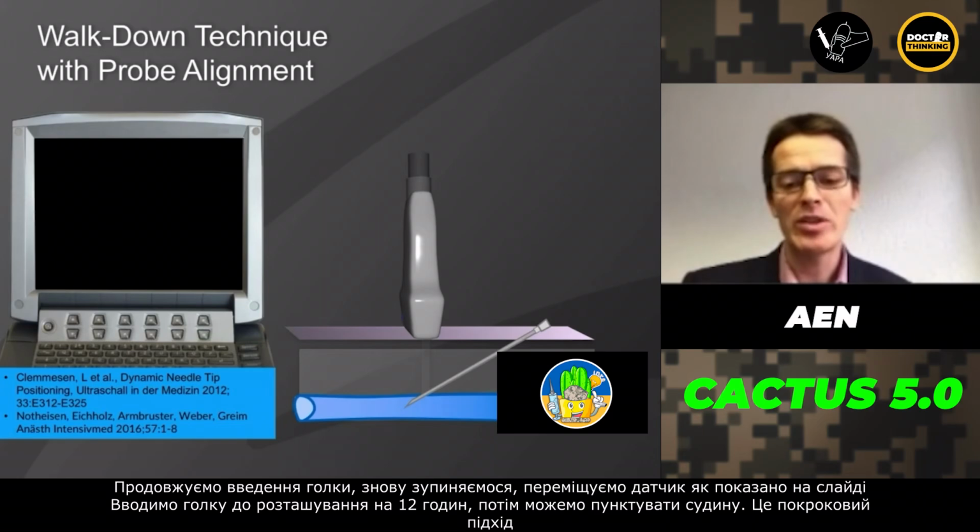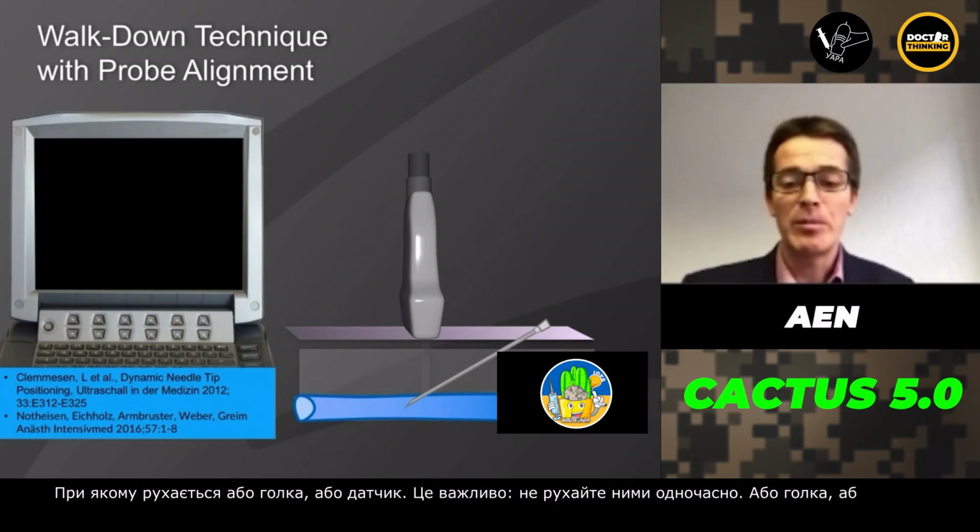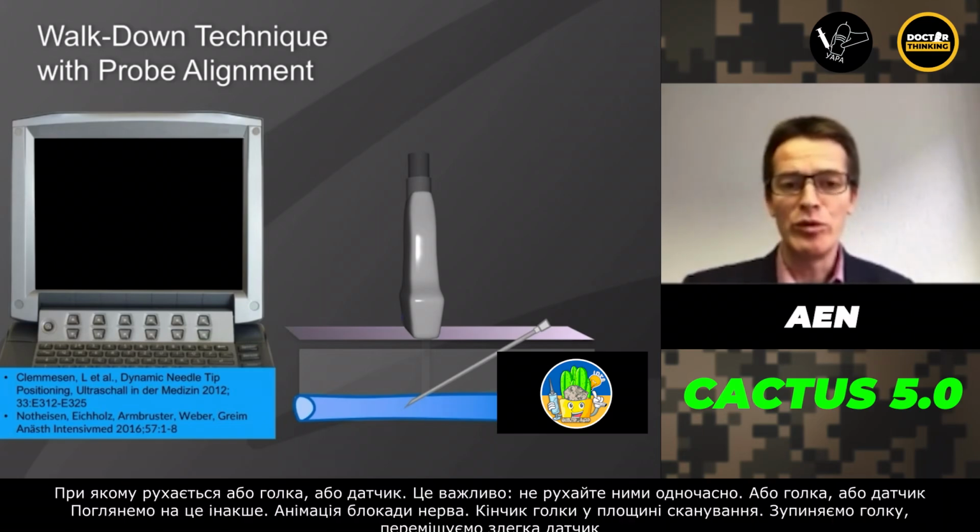So this is a stepwise approach where either the needle moves or the probe. This is very important information: don't move both at the same time. Either the needle or the probe.